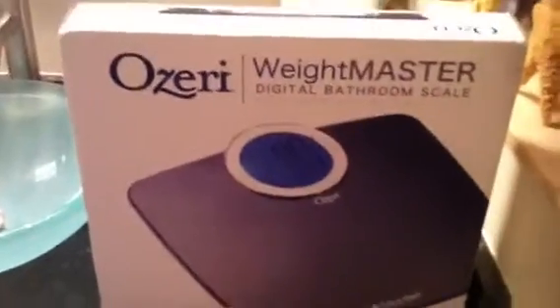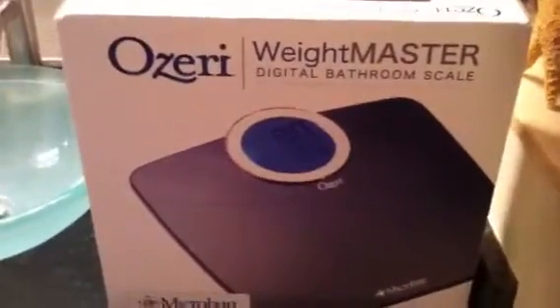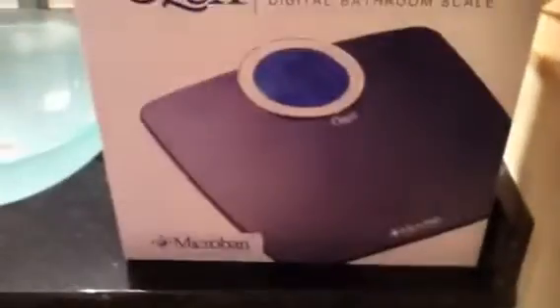This Saturday, that means it's weigh-in day. I received my Ozeri Weightmaster Digital Bathroom Scale to do a review on. I'm excited because my scale is 10 years old. There's my old scale. There's the new Ozeri scale.